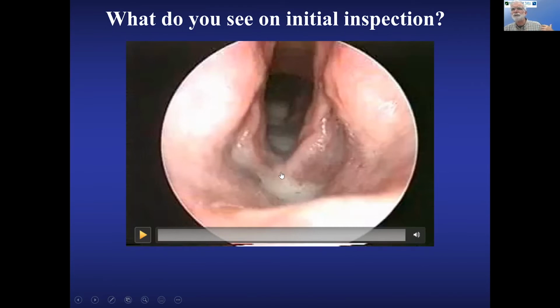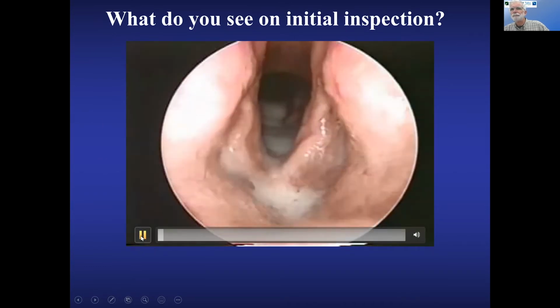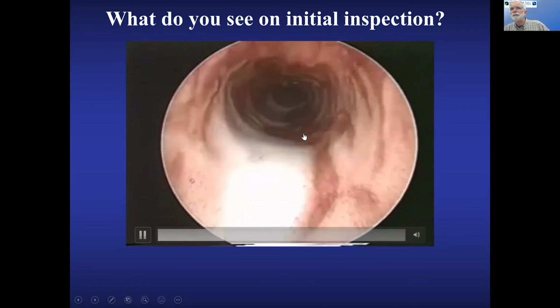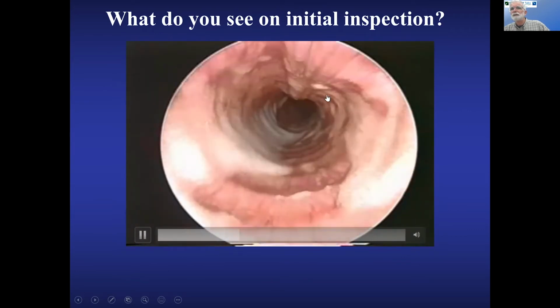I have a dog you may have just heard in the distance that has a problem with this that we've scoped a couple of times, once when she choked as a puppy, and then just last November here in Georgia to check to see if there's anything else going on. And she has secretions that build up and gags and coughs and probably something similar to this. So here you go. Thick cords, down the trachea. This is the cervical trachea and tailing off in the distance and should be coming back up.